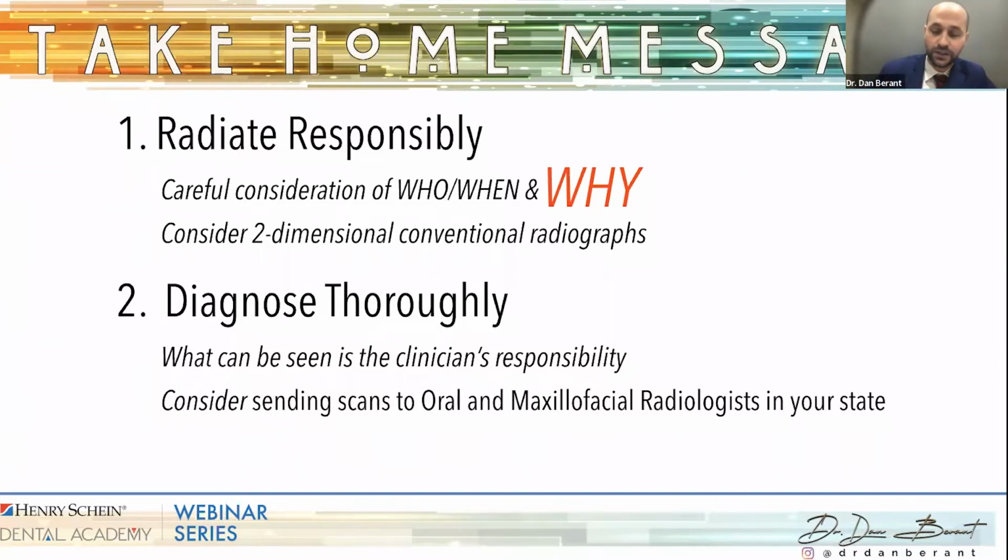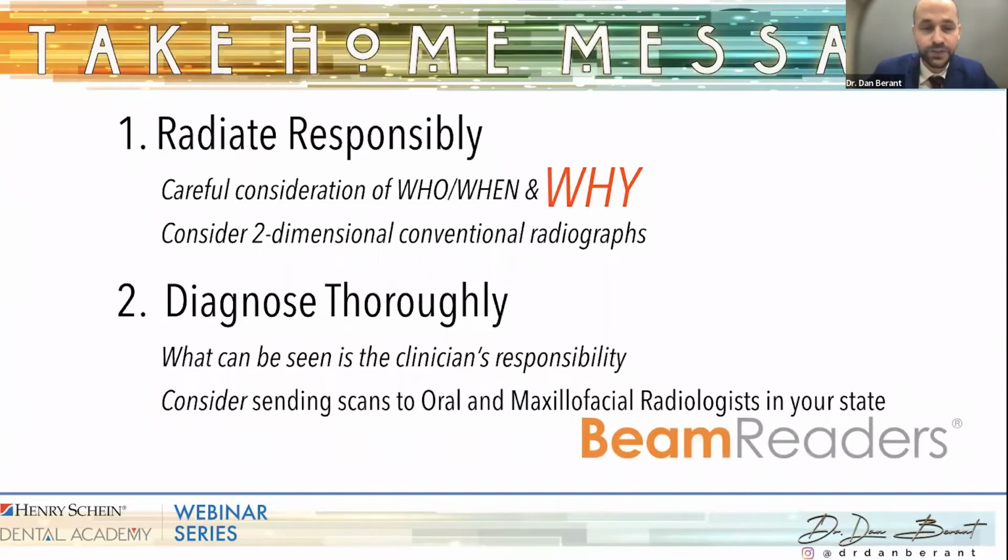And so I want to introduce you to a company called Beam Readers. You can send that to them or other oral and maxillofacial radiologists in your state to help with the interpretation of the cone beam CT. What I like to say to patients is, if I'm looking at a certain area and we captured more and I'm not sure of something, you can offer the patient, look, I'm a specialist in this particular area. There are specialists that spend their entire day looking at every single slice and section of this. Would it interest you to send it off to them? And then you can discuss with them any affiliated costs in the process from there.